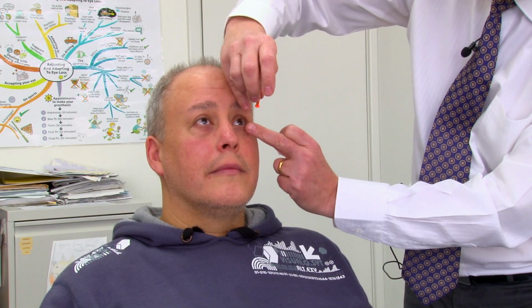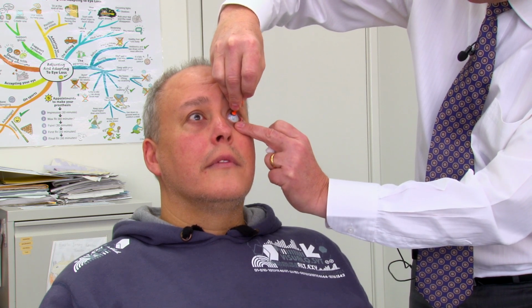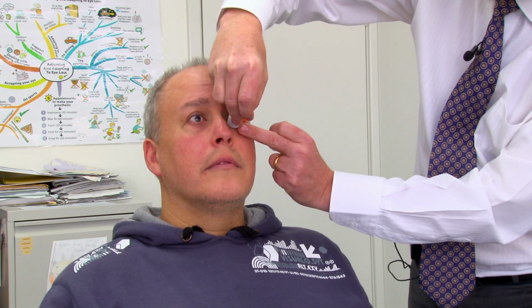So basically, you put the suction cup on the middle of the shell at the front and you want to lift it up slightly. The plan is to get the artificial eye to come out over the bottom lid. So you need to pull the bottom lid down slightly and then lift it down and out. The reason you do this is that the artificial eye sits over the ball in the back, and if you just pull it out, it could scrape across the front. And this can scratch the back of the eye socket, which makes it uncomfortable. So what you want to do is lift it forwards and down and over.